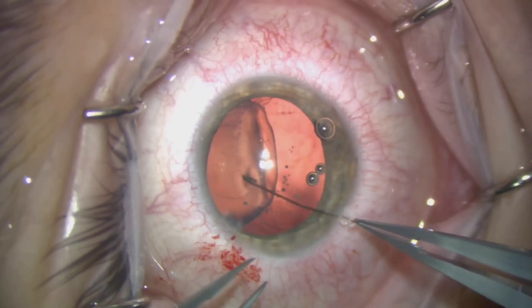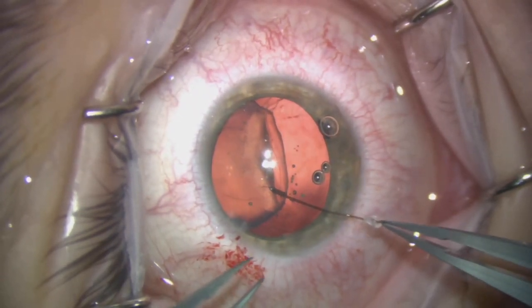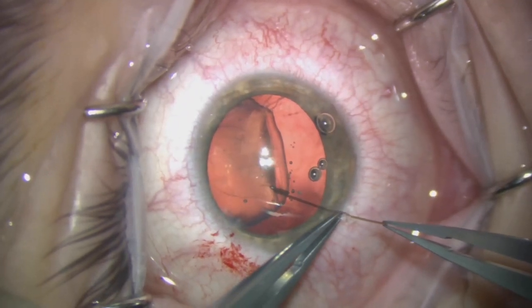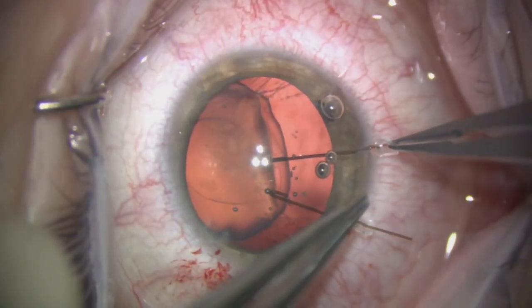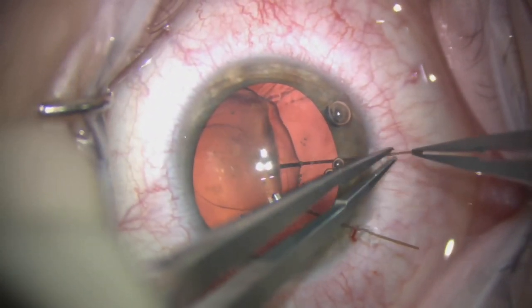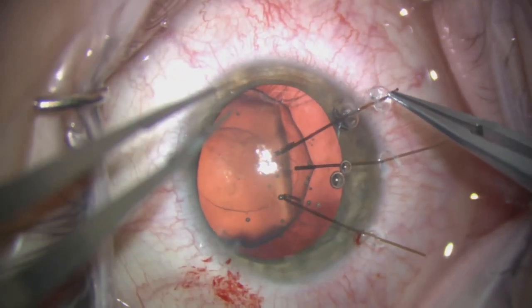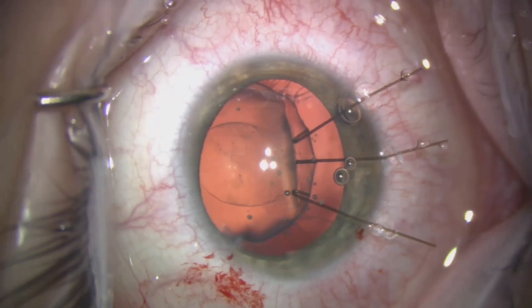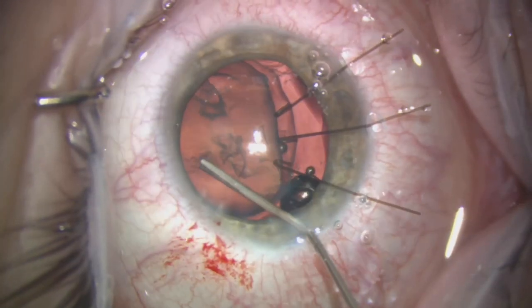We're now going to place some standard iris retractors to hold the edge of the capsulorrhexis. This allows us some counter-traction and we very gradually begin to move the capsular bag into a more central position.